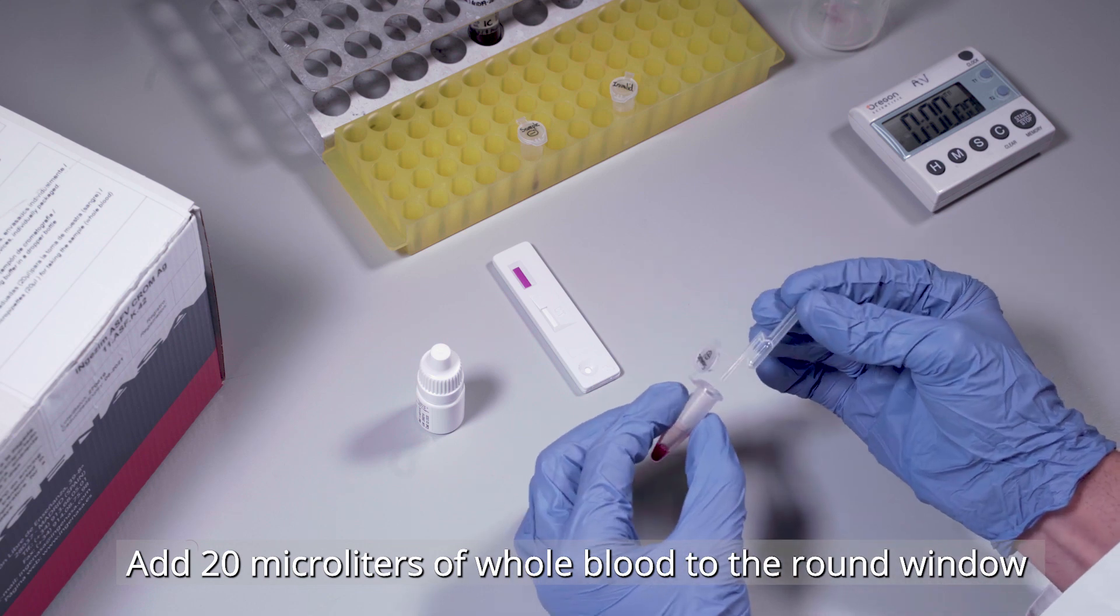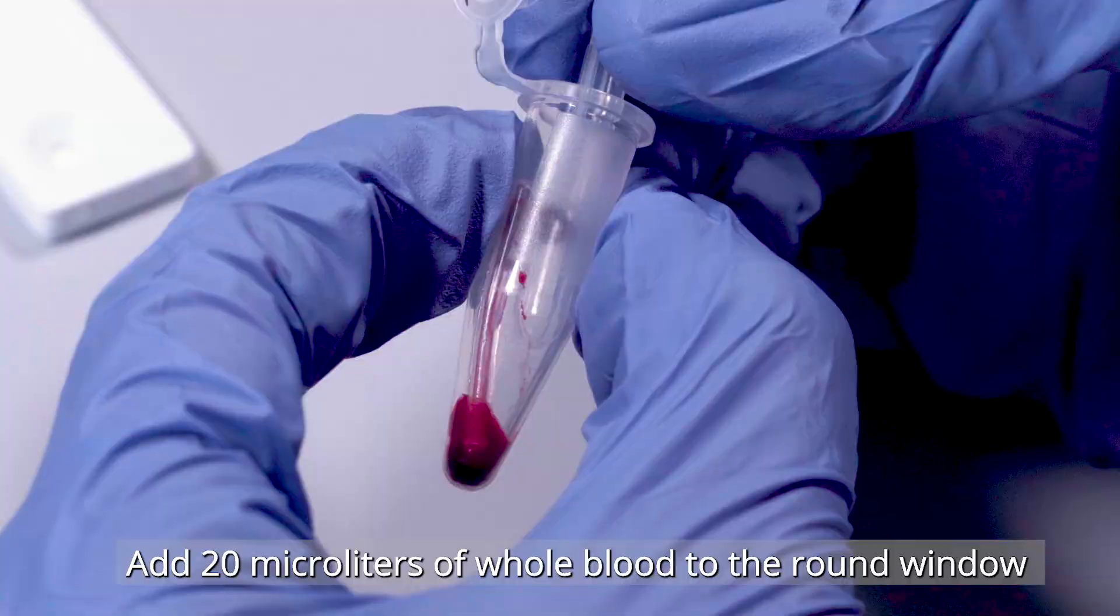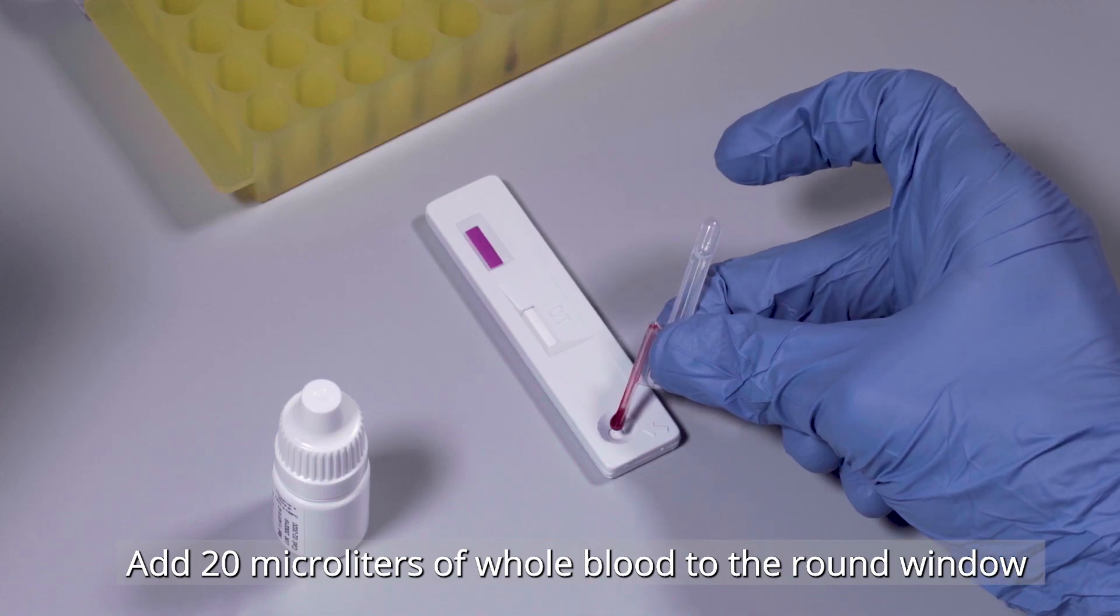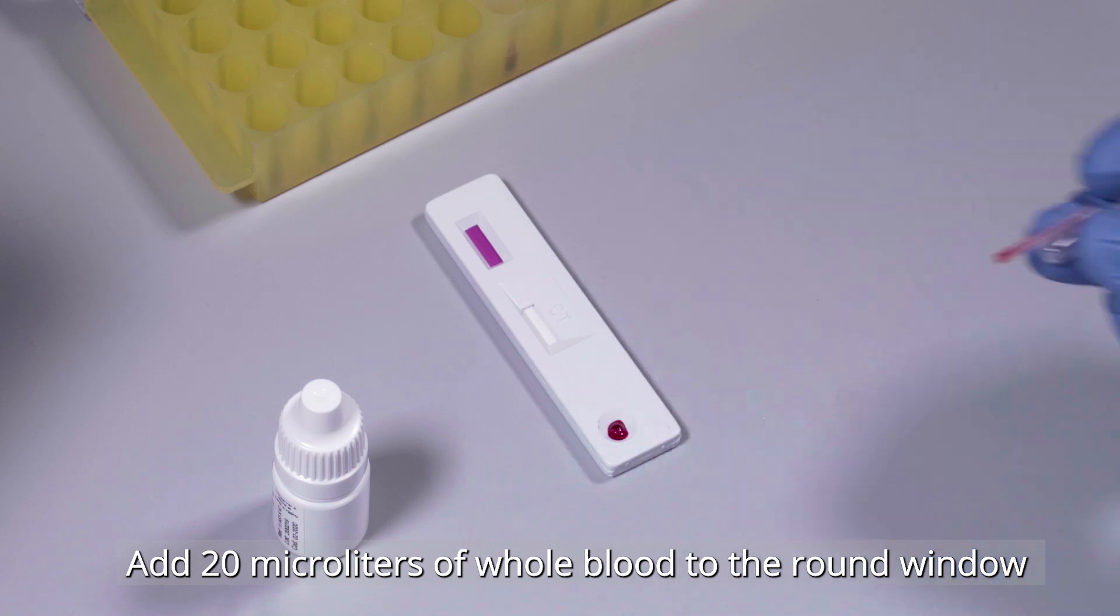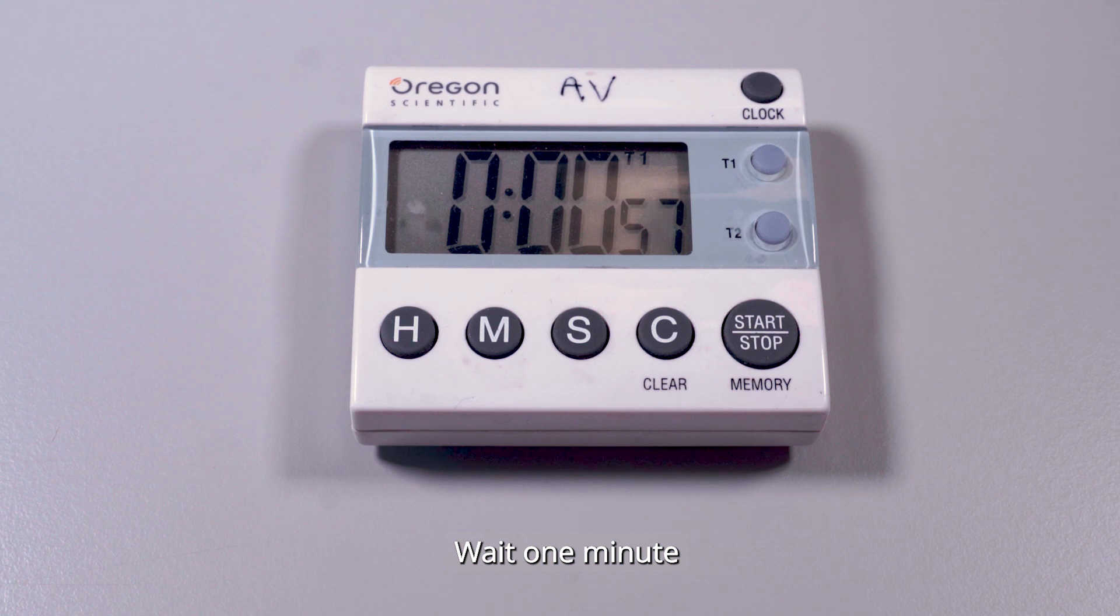Take 20 microliters of the whole blood sample using the micropipette and add them to the round window of the device. Wait 1 minute to allow the sample to absorb and the red blood cells to be filtered.